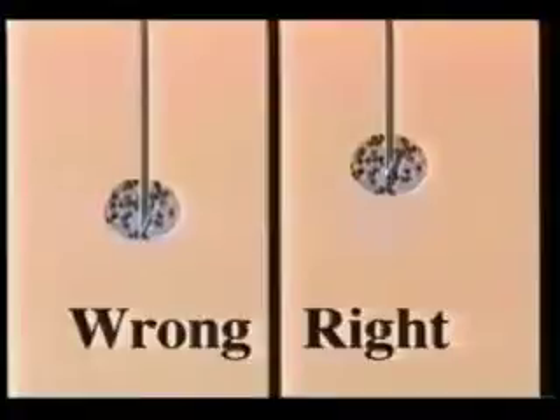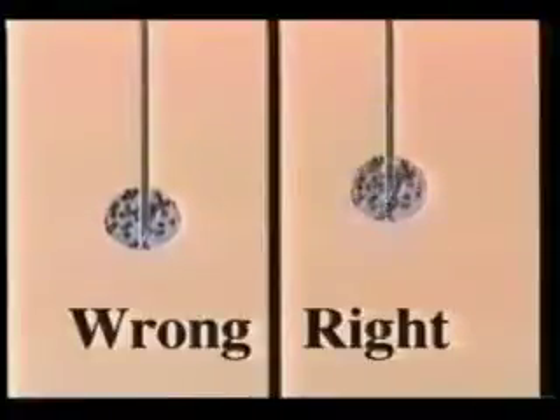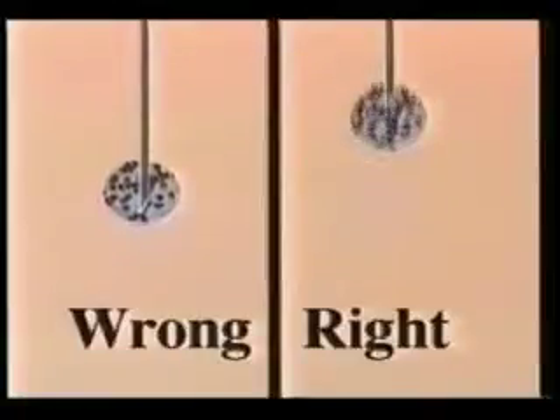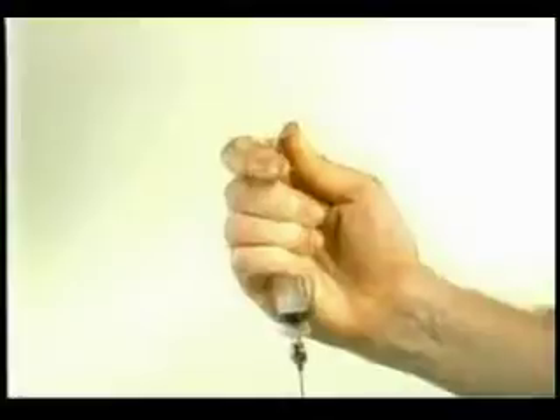It is crucial that the needle tip is truly moving through the target. Rotating the needle does not appear to improve the harvest. After the sample has been collected, the suction is released without delay. The needle with attached syringe is pulled out and immediately handed over for preparation of smears. Time here is of the essence. Therefore, the person who is going to prepare the material should be standing right next to the operator during the procedure.